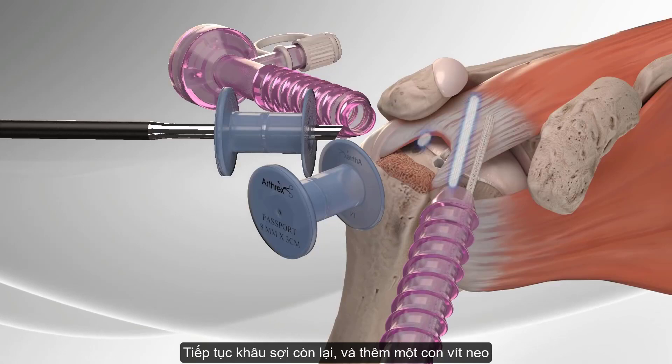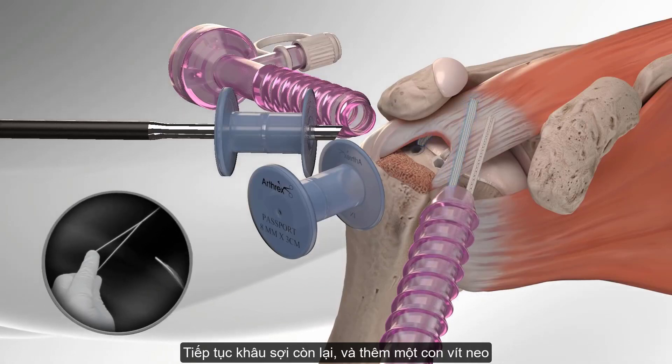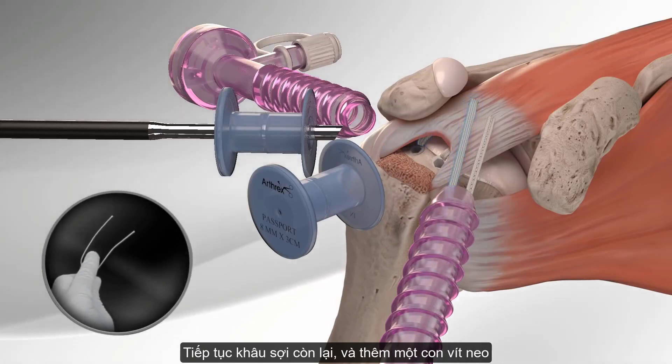The step is repeated for the second anchor. The fiber tape loop is then trimmed at the splice to separate the tails.